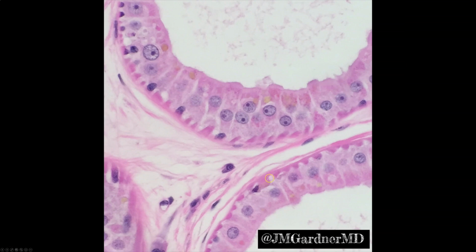Here's another one. This one's a little more flattened and doesn't have those nice snouts, the apocrine snouts. So just so you know, you don't always see those. And you can see also some of that lipofuscin, that golden kind of pigment in the cytoplasm. And there are some conditions where people can get pigmented sweat, actually, and I believe it's from lipofuscin getting into the secretion itself and causing pigmented coloration of the sweat.